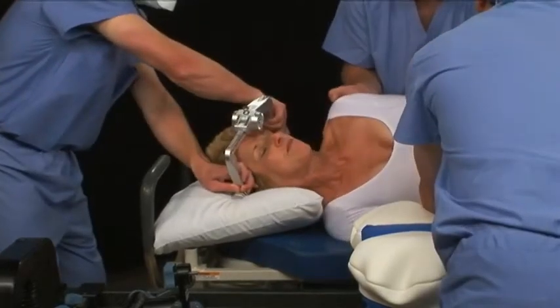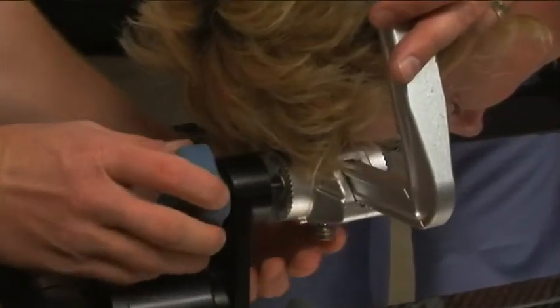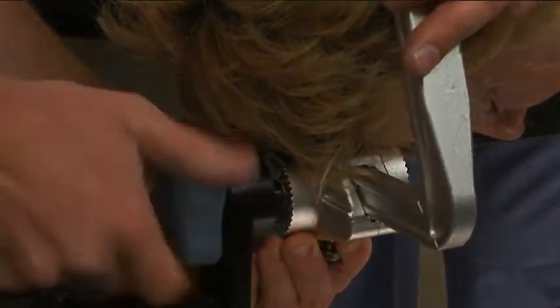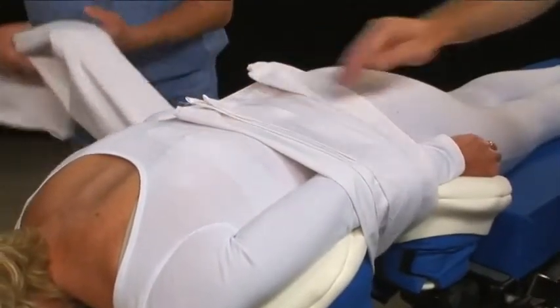Roll the patient onto the frame as before. Move the C-Flex to the skull clamp. Line up the starburst patterns and screw the adapter to the skull clamp. Tuck the patient's arms at her sides using the sheet draped between the wing set pieces.